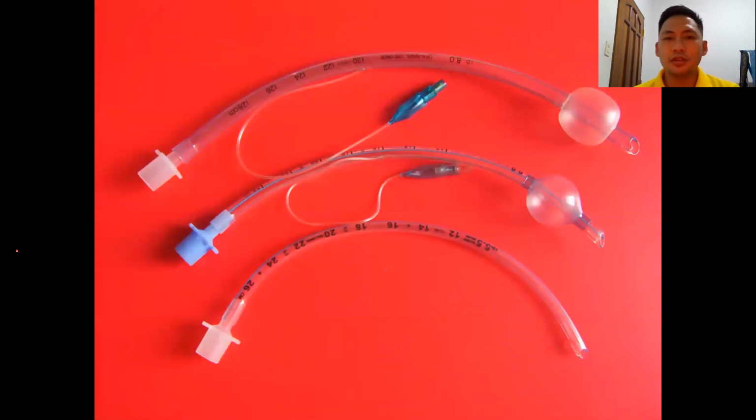This includes the endotracheal tube, and we have this pilot balloon, the cuff, and of course the ET tube. When you are preparing the patient for ET tube insertion, you have to make sure you prepare the following equipment.